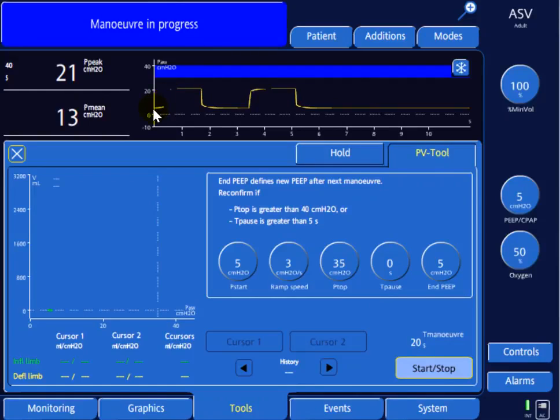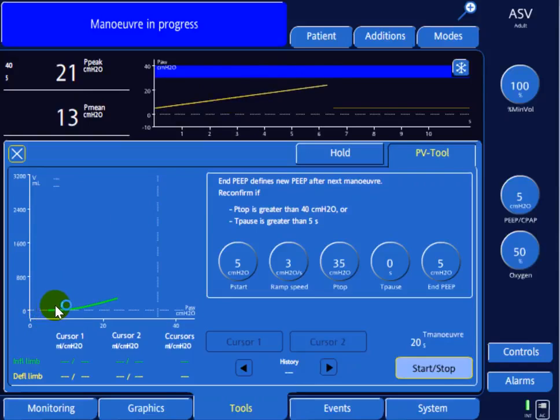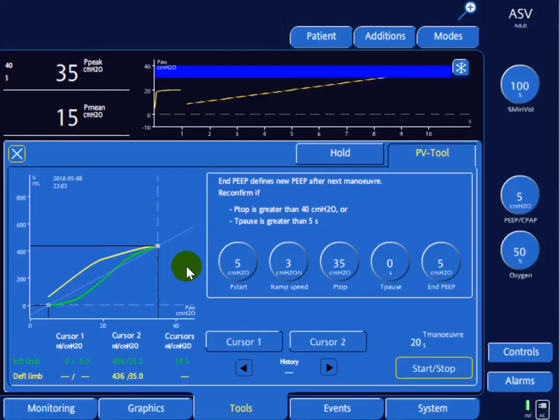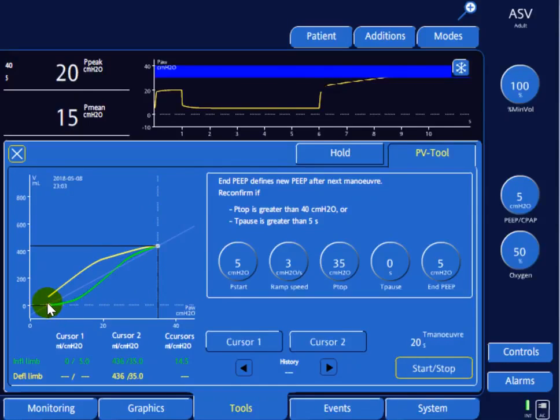You can see the pressure starting to rise on the x-axis. As pressure increases, volume enters the lung and is reflected on the y-axis. The maneuver is now finished and we can analyze the graph.